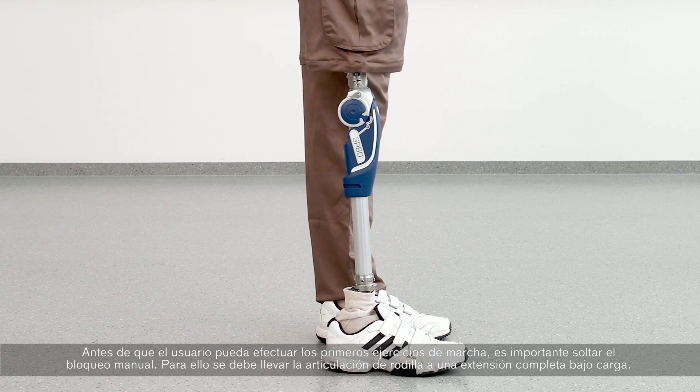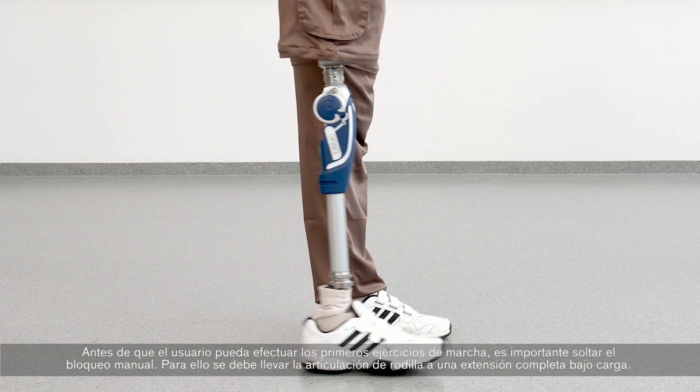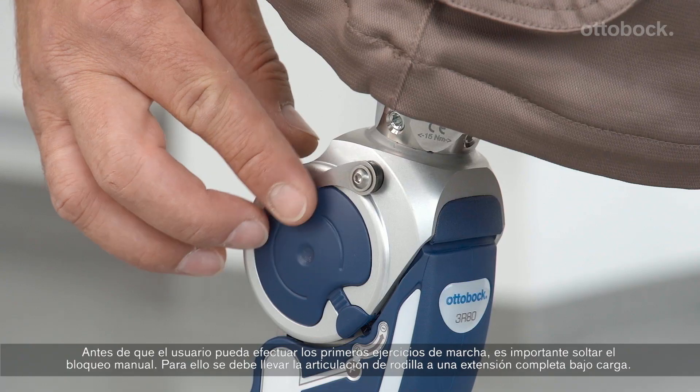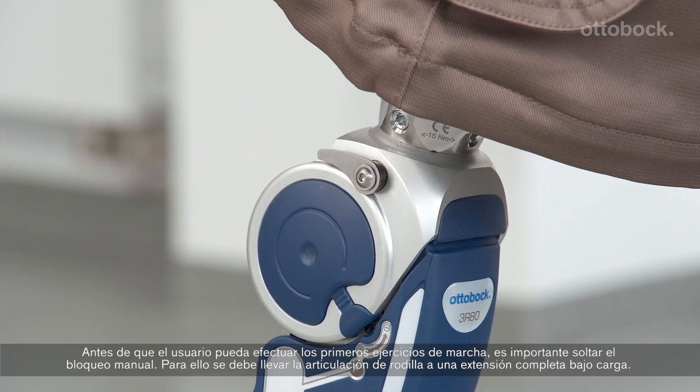Before the user can perform the first walking exercises, it is important to disengage the manual lock. To do so, the knee has to be brought to full extension under load.